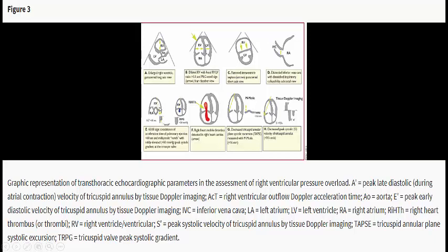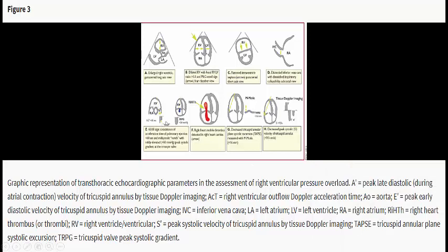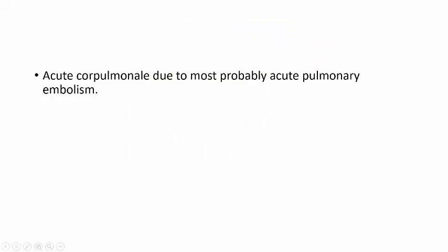In our patient, the pulmonary artery systolic acceleration time is very quick, and there is no notched flow, and also the pulmonary artery systolic pressure is low. The 60/60 sign is positive. There is no thrombus, but there is very low function of the right side by low TAPSE in our patient. So all signs of pulmonary embolism are present in our patient.